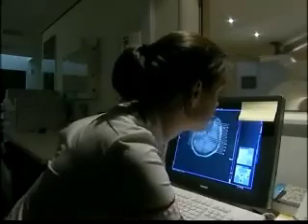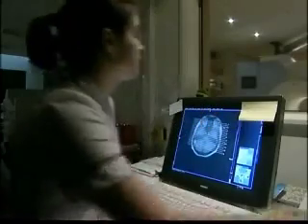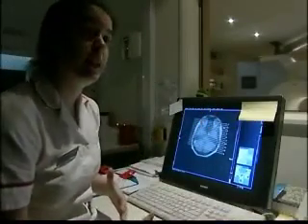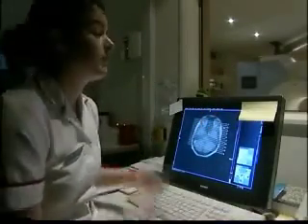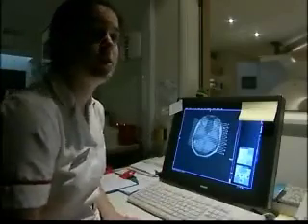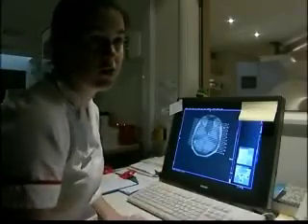Your first scan is just about to start. Each scan takes about five minutes, and then after that we can have a look through the images and see what we've got.